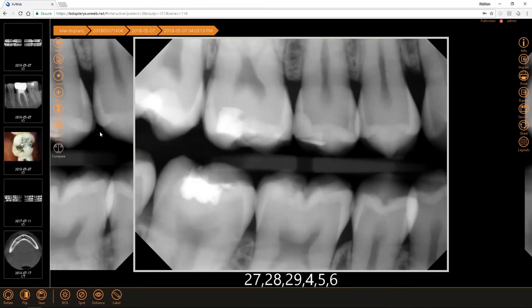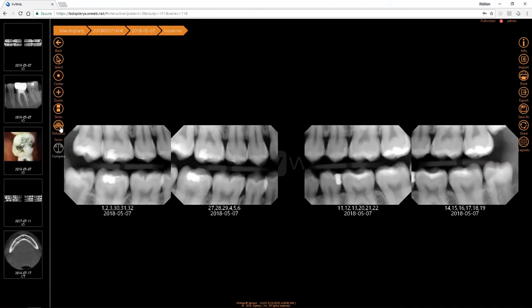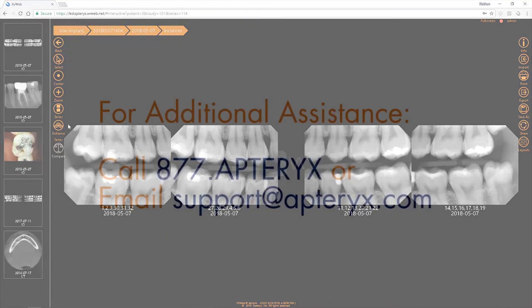One additional tool to note is the enhancement for the series. This will apply the sensor filter that you set as your default filter for the entire series. And that completes the tutorial on the adjustment tools for individual images.